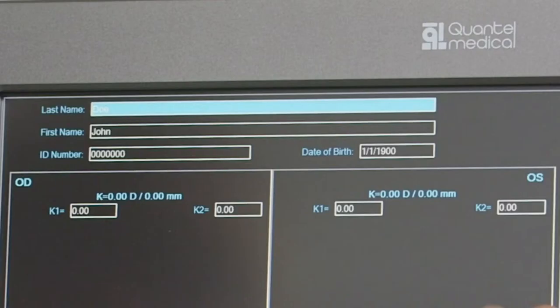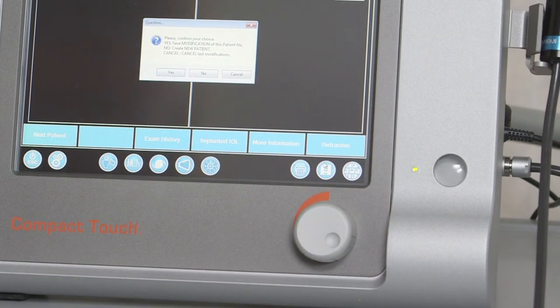Once a patient is selected, the examiner can enter two keratometry values for each eye. For patients who have had corneal refractive surgery, IOL calculation can be more complex. Selecting Refractive allows the examiner to enter additional parameters that may help determine IOL power in these cases.